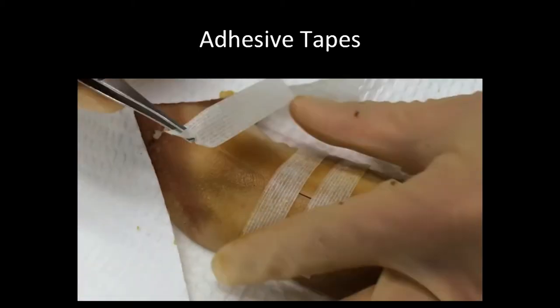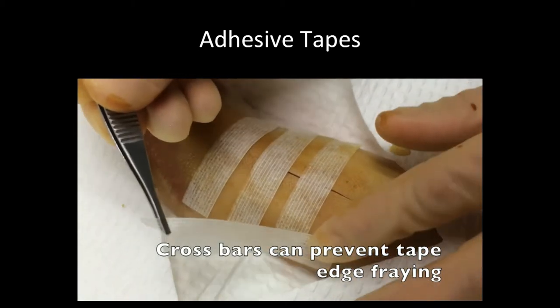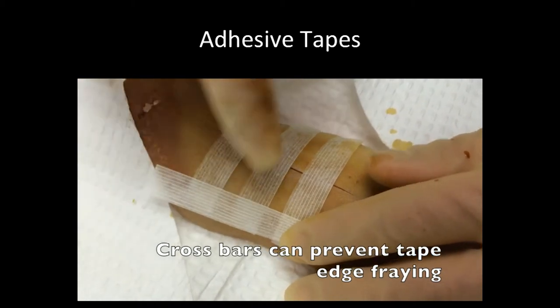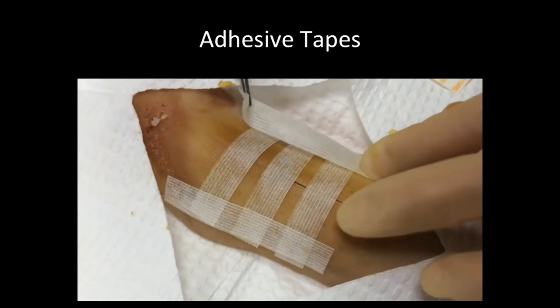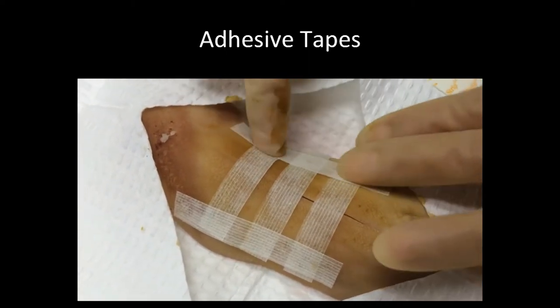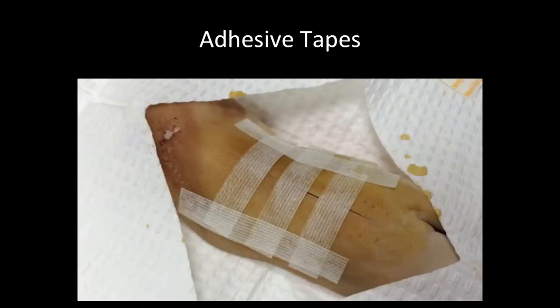You can go ahead and apply these strips across the margins of a wound. And another tip is to apply crossbars like train tracks on either side of the wound where the Steri-Strips end. This prevents fraying of those edges of the strips and prevents them from prematurely coming off of the wound. And that's an easy way to close a wound under minimal tension.